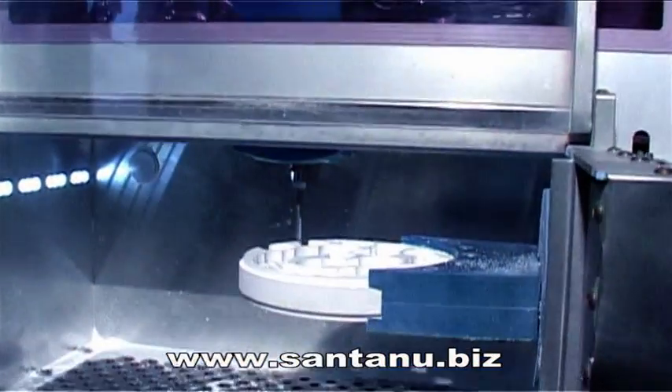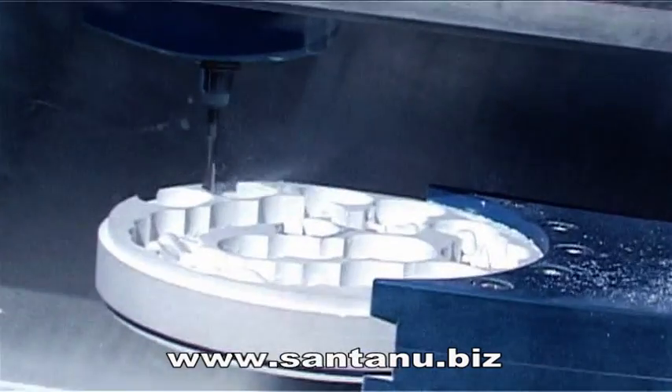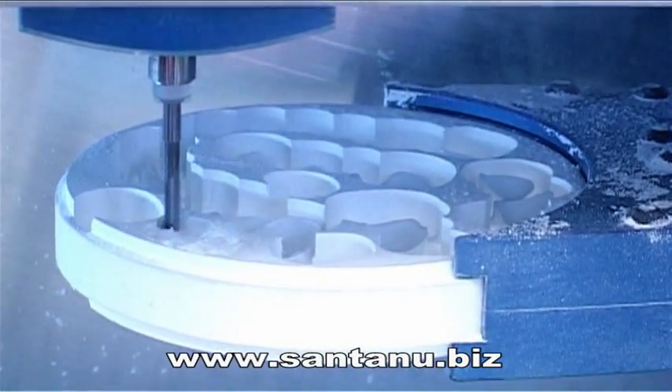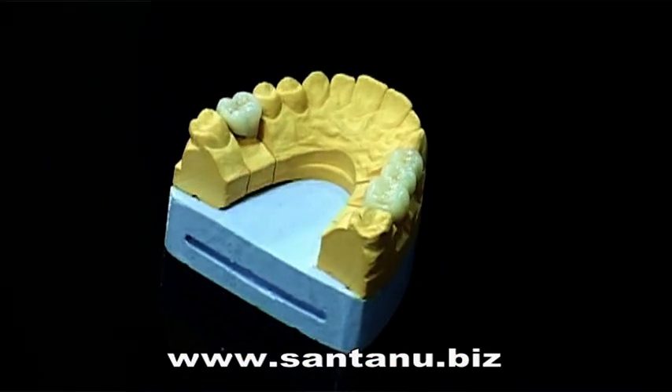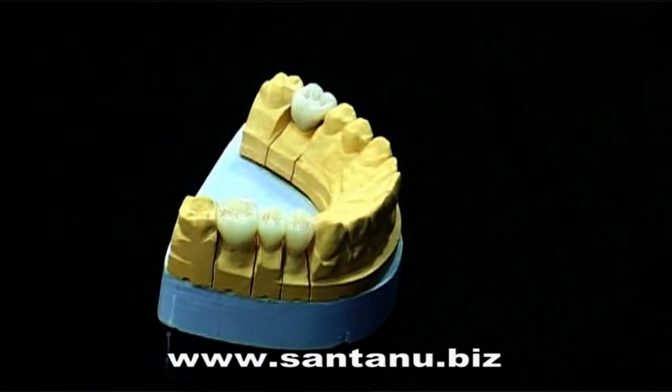Using a 4-axis high precision CAD-CAM milling machine, the fourth axis ensures that all intricate dental curves and angles are captured, thereby creating the finest fitting crowns that allows a dentist to maintain the natural tooth anatomy.